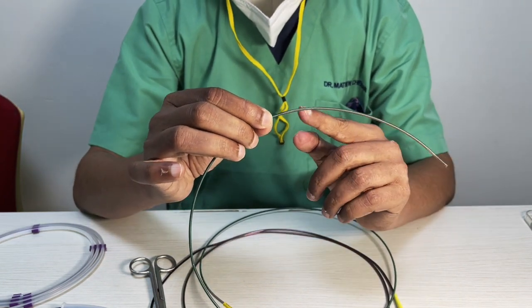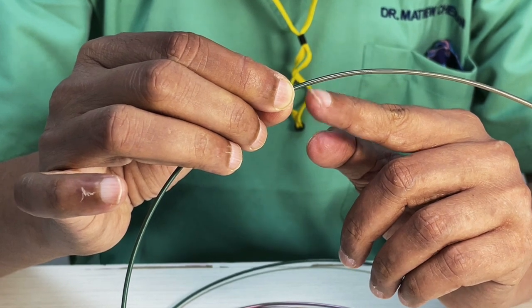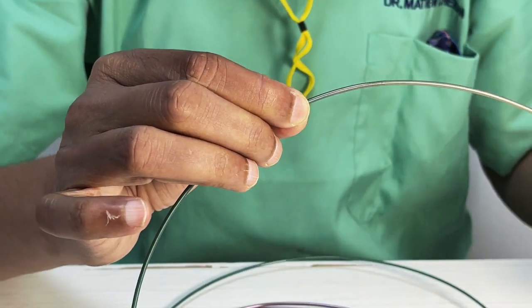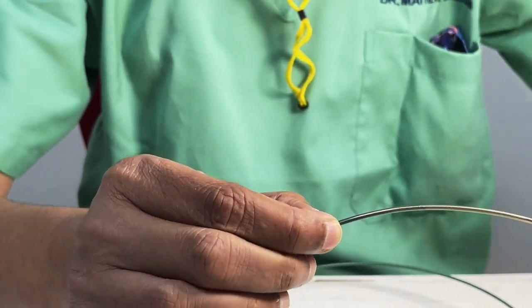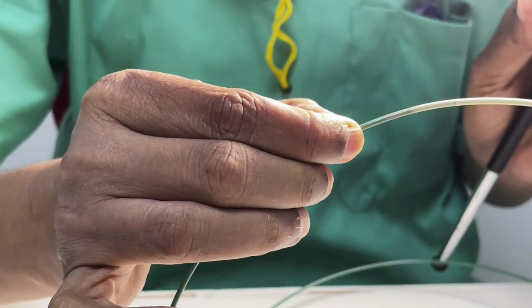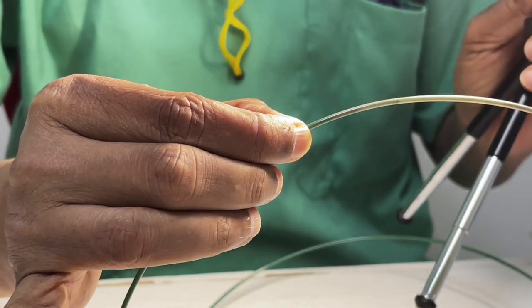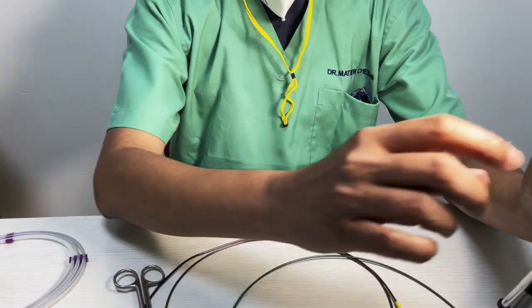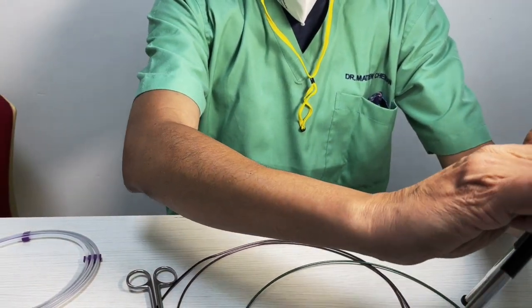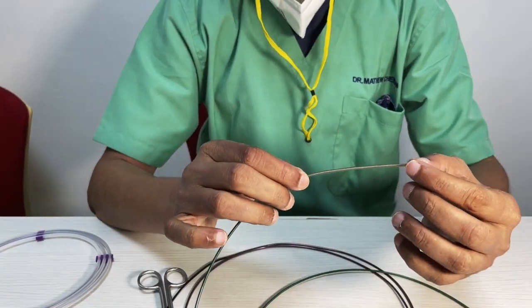You can actually see the braiding over here. Can you look at it here? Maybe you can see it. I'm not sure, but if you can make out the braiding, I'll just try to get the light from another direction, hoping that you can actually see the braiding. You may be able to see it better now. And this makes you understand that this is the pattern that they use for actually enabling us to do the procedure better.